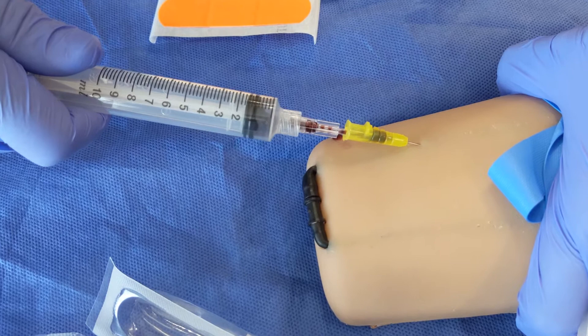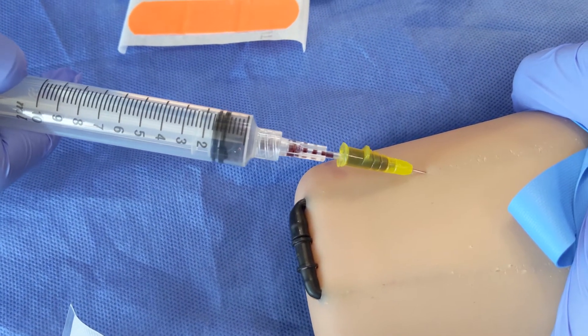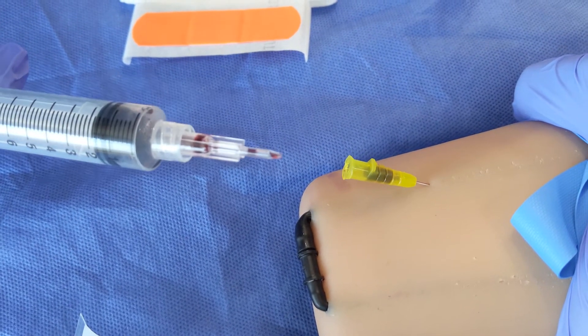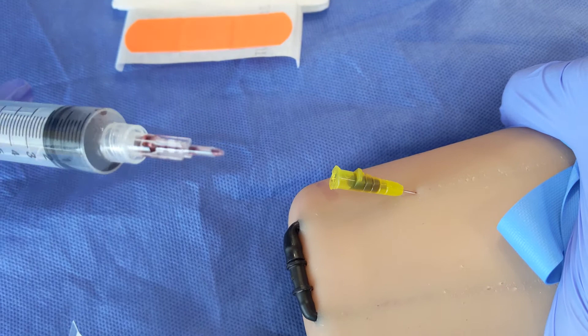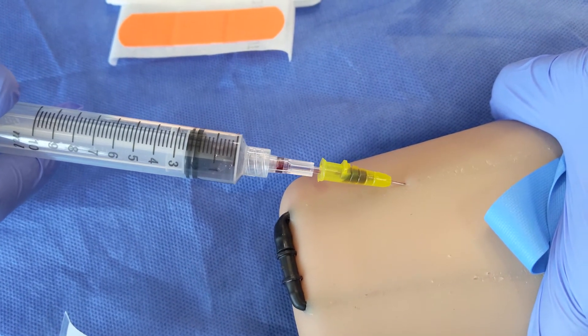Again, this is mostly for very small babies who have very small veins. So typically we need 2.5 to 5cc's, which would work just fine with this method. We are being very careful, obviously, that we're not touching the skin or anything else with this blunt cannula.